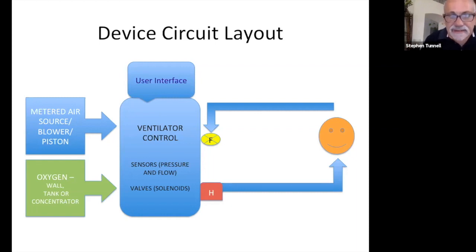So that is a general layout of what's happening with a patient. Steve, I have a question.